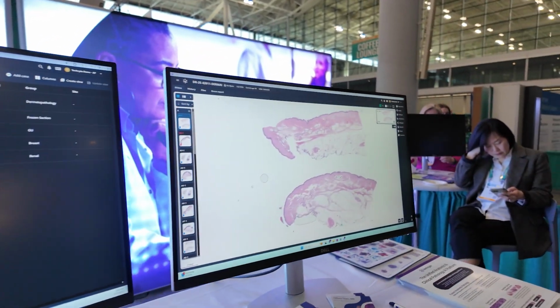Yeah, and some users like multiple monitors. They have two, or they'll stack two or three. So we just want to support whatever users want, and we're not going to force you to do one or the other. We're also exploring ways to view on tablets and other types of screens because we understand people may be on the go, but they want to review, so we want to make it easy for them to use. Right now we have it set for two.